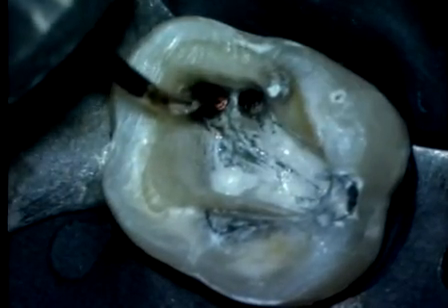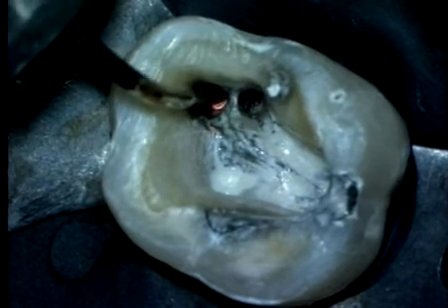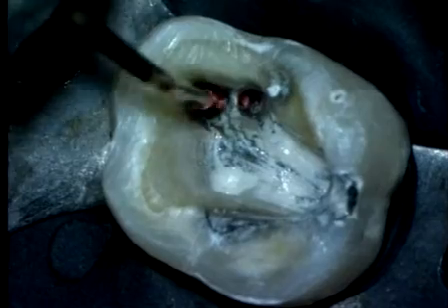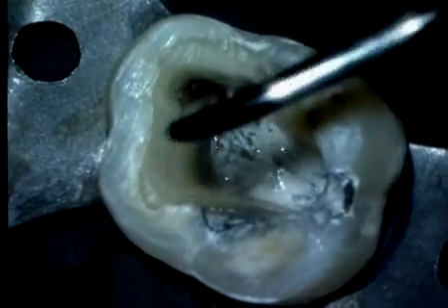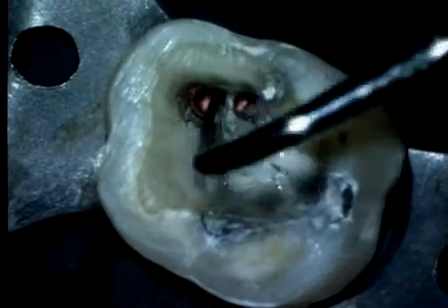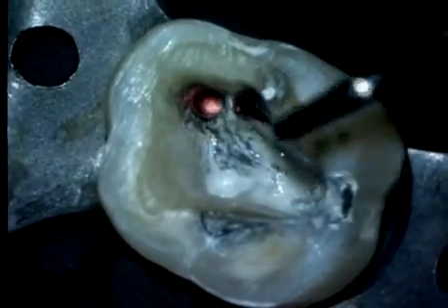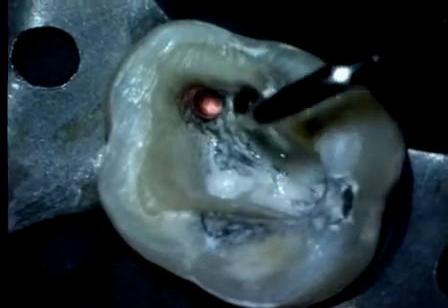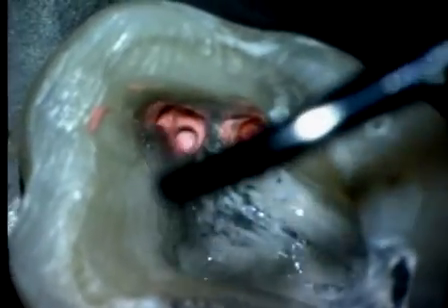The 23 gauge needle is placed against the previously established gutta percha core. A small aliquot of thermosoftened gutta percha is injected. The smallest plugger steps circumferentially around the canal walls to generate a reverse wave of condensation. We inject more gutta percha progressively into each system, and by compacting this thermosoftened gutta percha into the root canal space, we progress with the reverse filling technique.